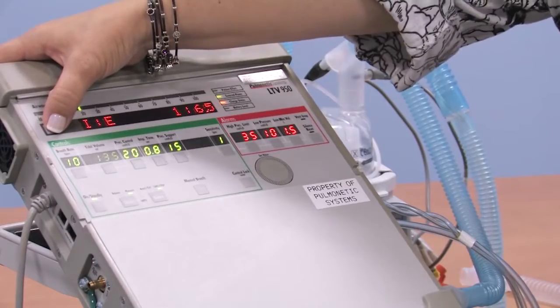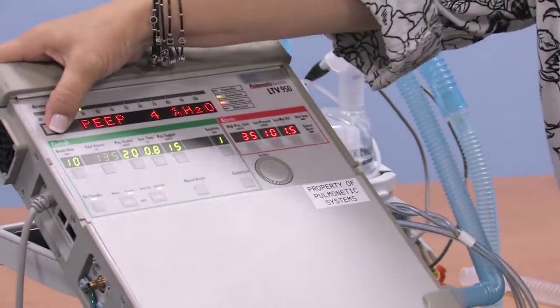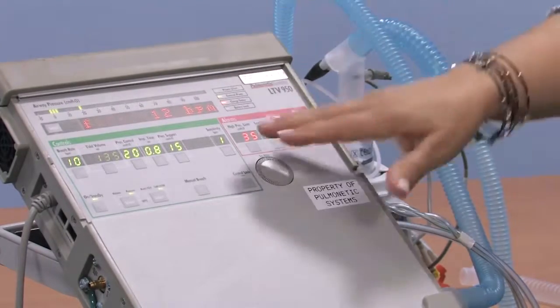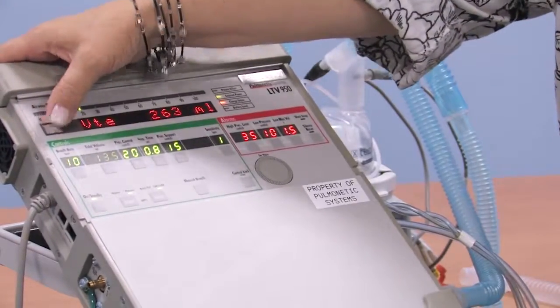We can hit this button twice quick and it will scroll all those numbers, or perhaps you want to set it on F and watch your child's respiratory rate. And this goes for your nurses as well. They're welcome to look at certain numbers and or have it scroll, or certainly just push the button and find the number that you want.